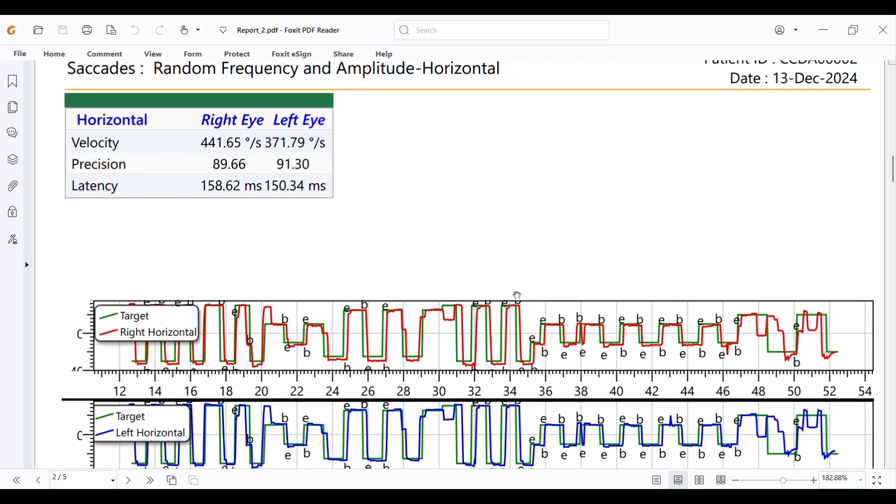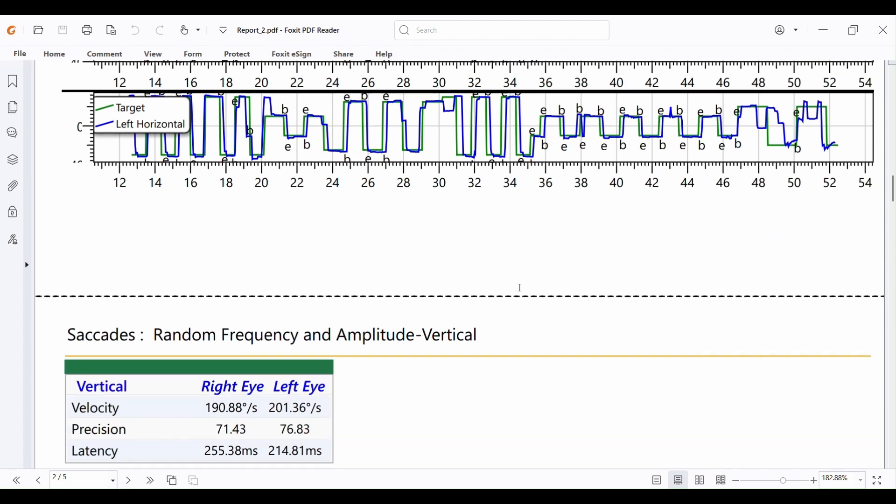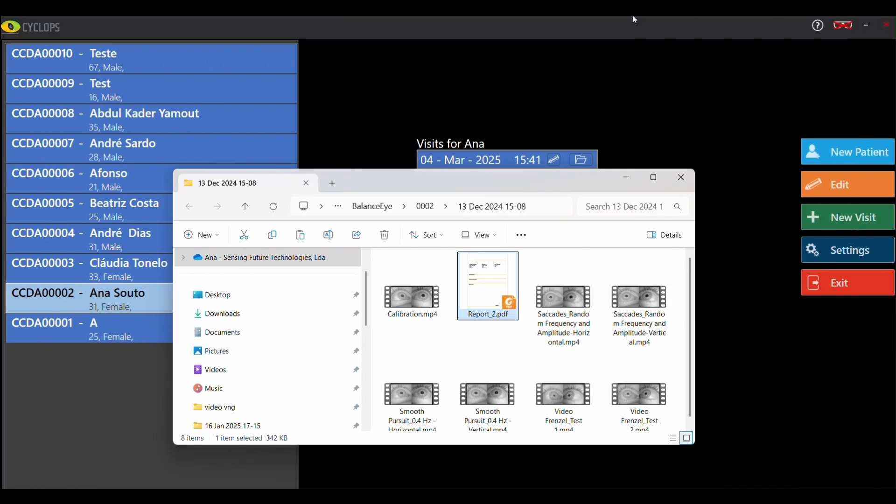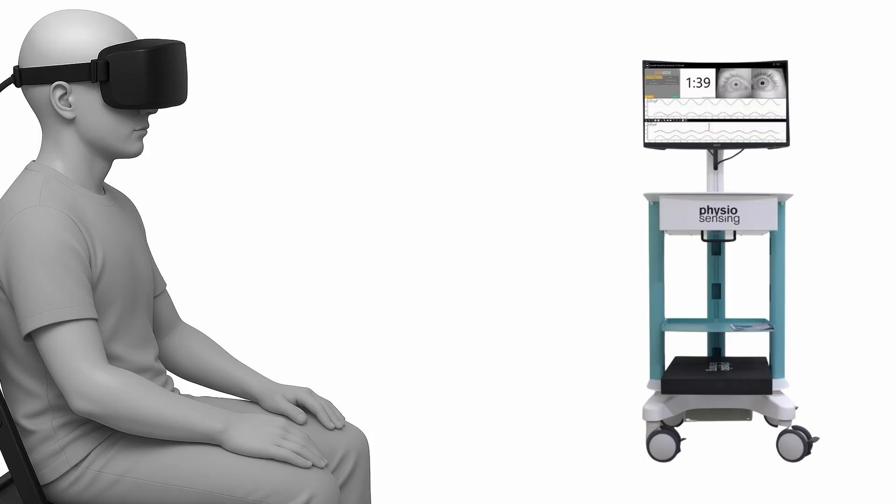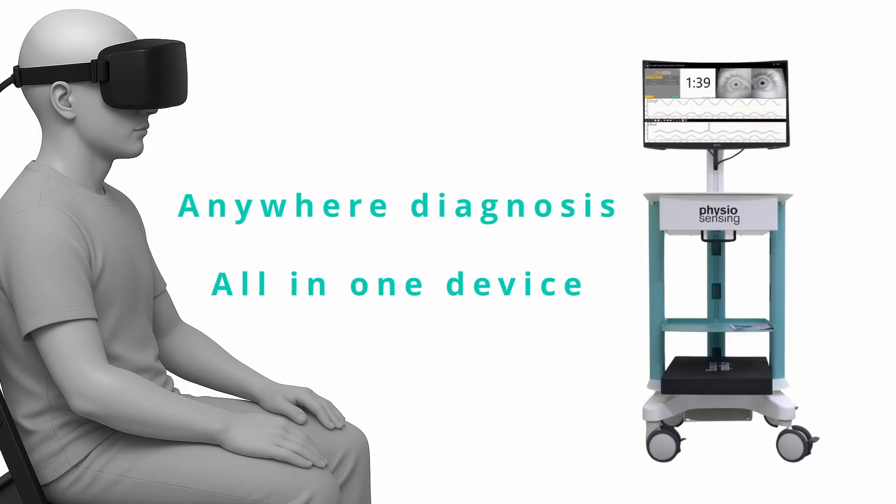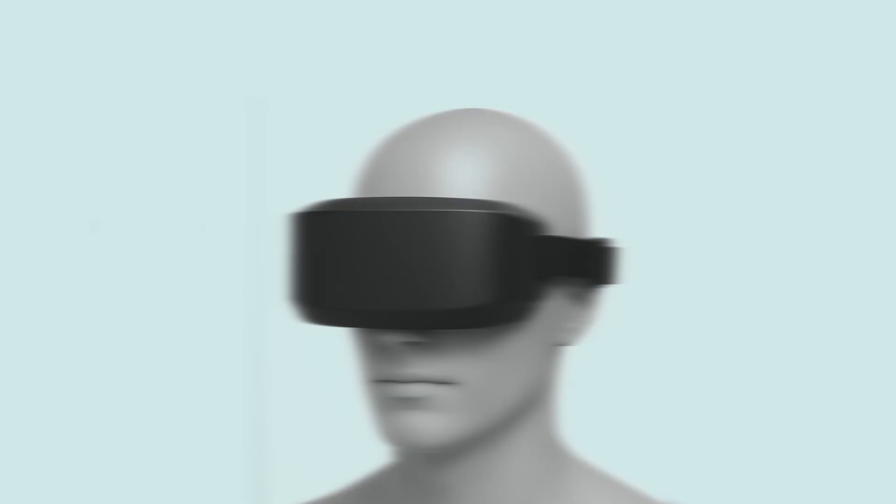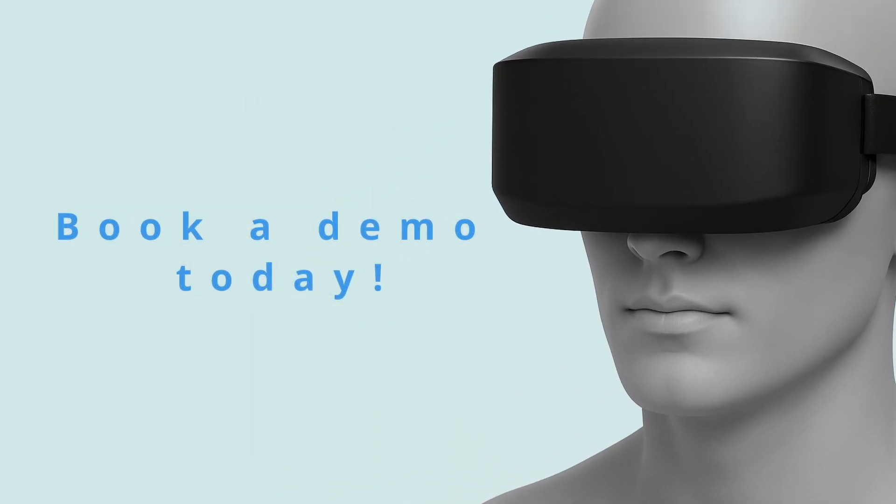With a compact footprint, remote navigation and laptop based operation, the VNGi offers true point of care flexibility from private clinics to mobile diagnostic units. Book your personalized demonstration today and explore how the VNGi can transform your vestibular assessment workflow.